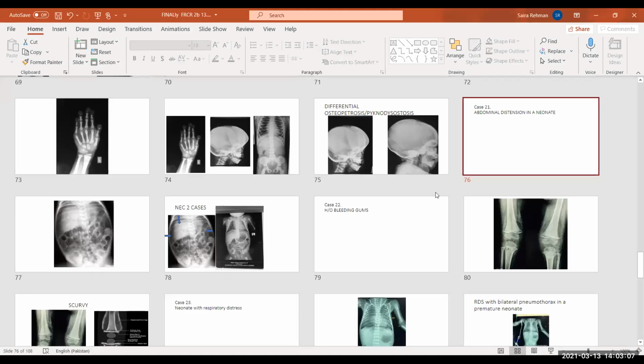Somebody has also asked that in suspected perforation also, of course, we will not go for barium enema, right, madam? Of course. That is why I always do a plain radiograph for whatever study I'm doing on fluoroscopy, because that gives you so much information. Even afterwards, for comparison, you can go to the plain film and see whether you're seeing some artifact or something that was already there. You see? Yes, ma'am.